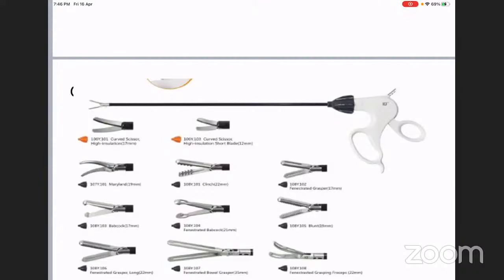There should not be any breaks in the sheath, or else it can lead to various electrothermal injuries during laparoscopic surgery, such as direct and indirect coupling injuries. Again, this is something that you need to read up on. Read up about the electrosurgical unit, the different types of electrosurgical devices such as monopolar, bipolar, cautery, and other energy sources in surgery such as harmonic scalpel and advanced bipolar devices. It is certainly desirable to know about all of them.